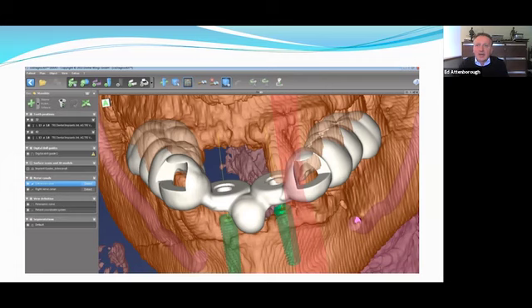things should happen where they need to happen, and we should perhaps view the intraoral scanning devices as primarily impressioning devices that have the ability to do some workflows and treatment augmentation chairside. We'll come on to look at some of those others, but certainly automatic design of provisional restorations and milling chairside is one very good application of it, as is orthodontics and outcome simulation, as mentioned in the video we saw earlier, but we'll come on to talk about those in a bit more detail later on.